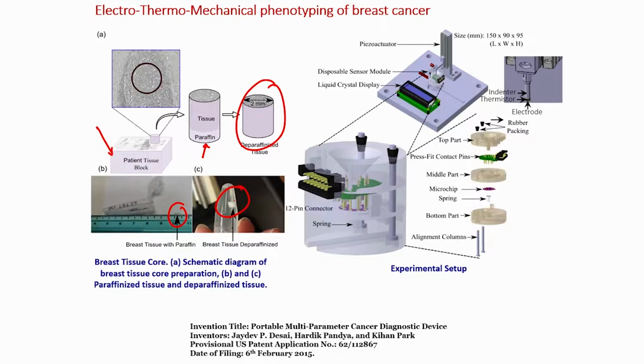Alright. Now, this tissue you have to place in this particular conical or cone shaped holder, and if you see here, the chip, or a microchip or biochip, is placed inside this particular 3D printed case holder.